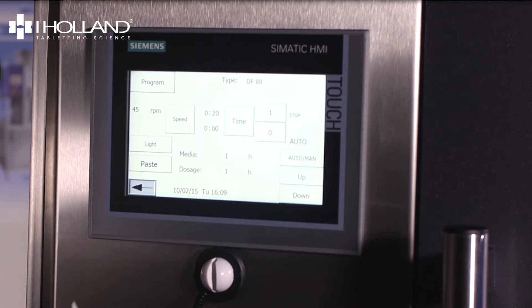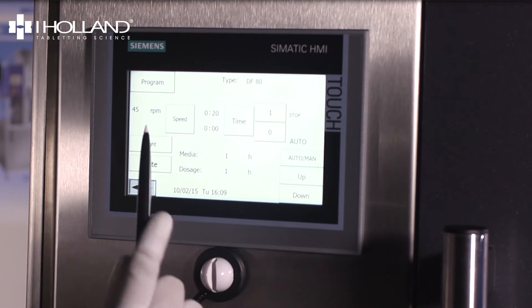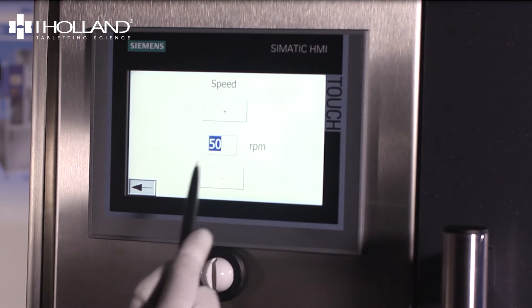Polishing parameters should be set according to instructions. We recommend setting the speed to 45 rotations per minute and the time to 20 minutes. We would also recommend running the machine in automatic.